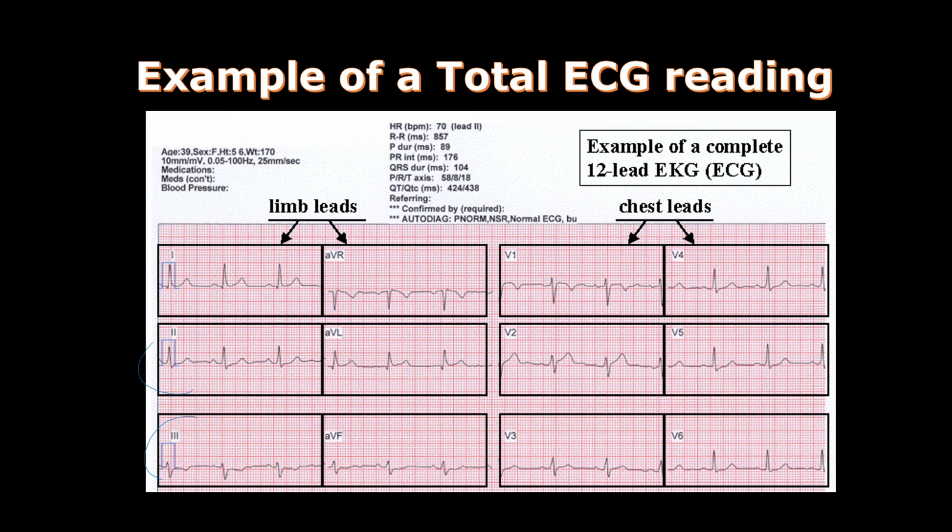I'm going to upload an ECG reading to Blackboard, but in that case only the recording of the lead 2 configuration. So you need to measure all the intervals that I already described.